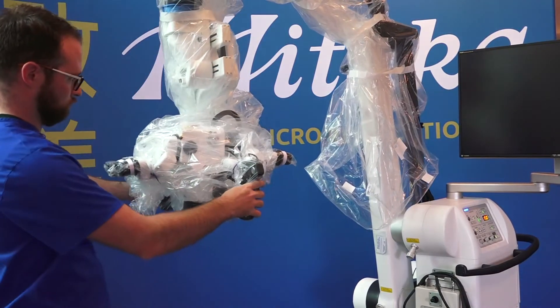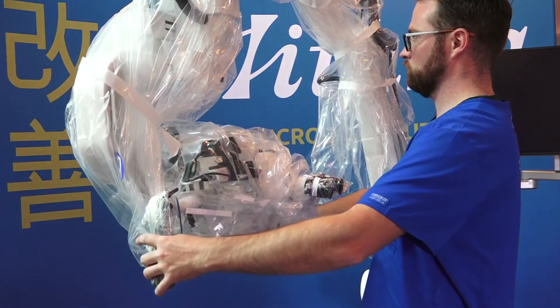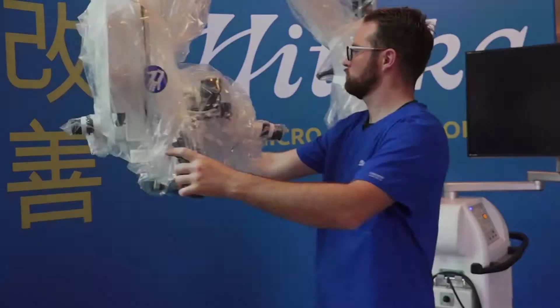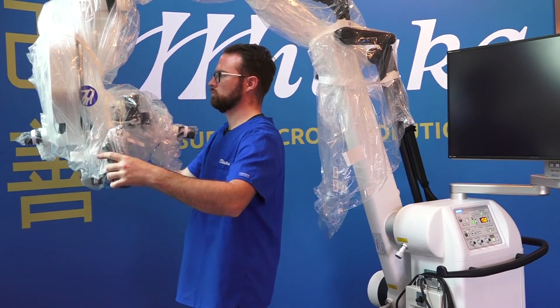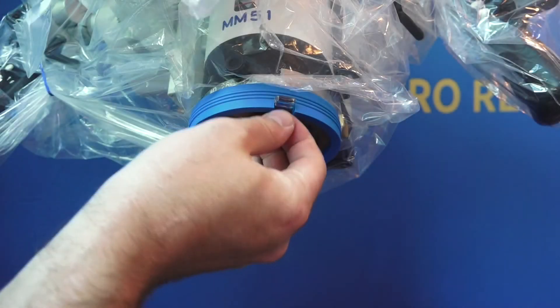Now that all the straps and rubber bands have been secured, it is necessary to test the movement of the microscope. Rotation and movement along the X, Y, and Z axis all should be fully functional. It is important after draping for the plastic to be tight enough to stand easily under the horizontal arm without compromising sterility.